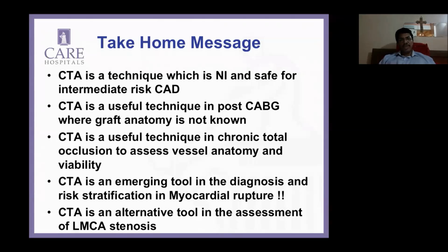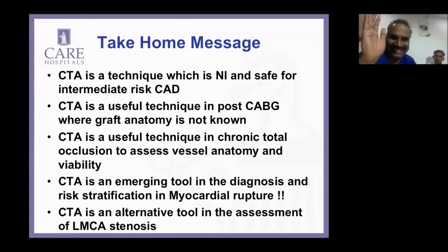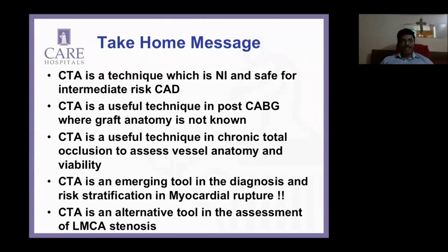Yeah. And the other thing I just want to put across: I've been doing angios a lot, but how many of us are really doing QCA? I just like to put this question across. How many of us are really doing QCA? In fact, I have a BMJ article, which I don't mind sending across. I never used it. It is a radiologist's perspective, and it finally asks whether cardiologists are doing QCA on a large scale. This is a BMJ article, and I can just send it across to one of you.